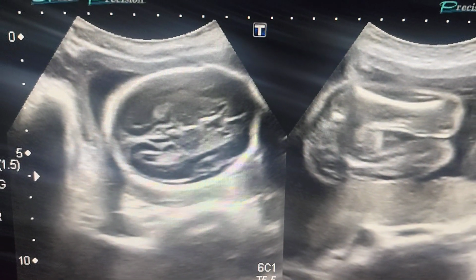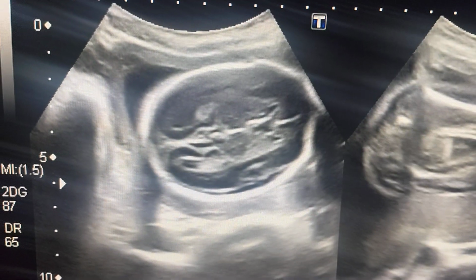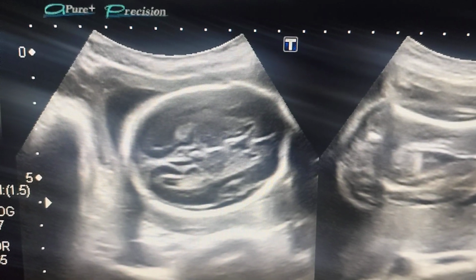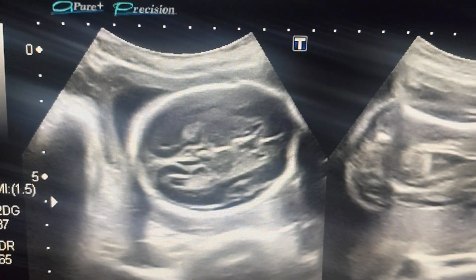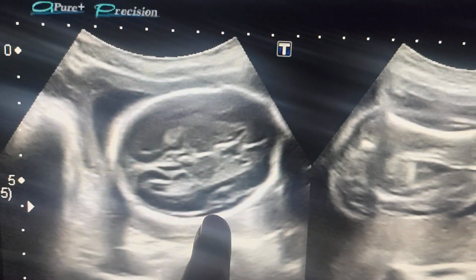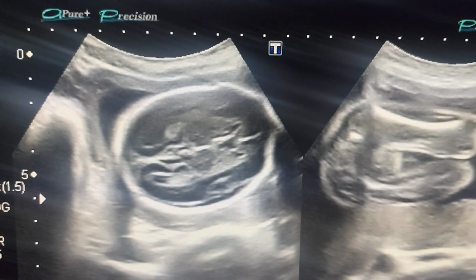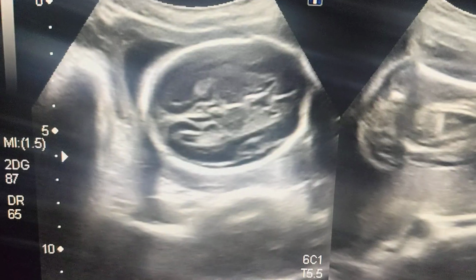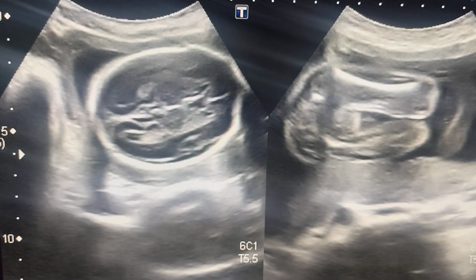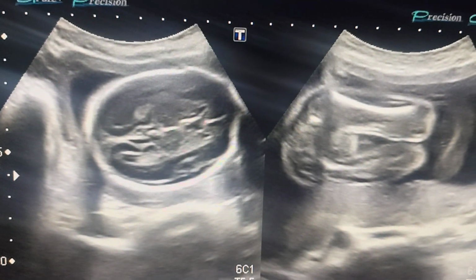Biparietal diameter is a key measurement taken during the obstetric ultrasound, particularly in the second trimester of pregnancy. Biparietal diameter is the distance between two sides of the fetal head, from one parietal bone to the second. We measure it from one parietal bone outer edge to the inner edge of the other parietal bone.